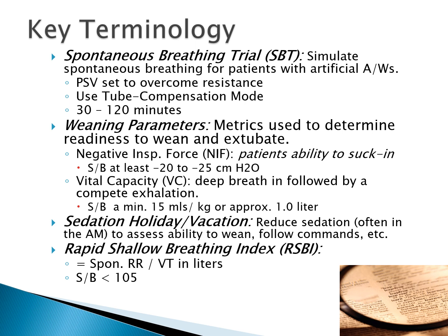So, what you really want to see is that RSBI, or rapid shallow breathing index, being less than 105. The closer it is to 105, the less good it is. It's also problematic if it's extraordinarily low. You get patients sometimes that are waking up from sedation. They're not quite awake.